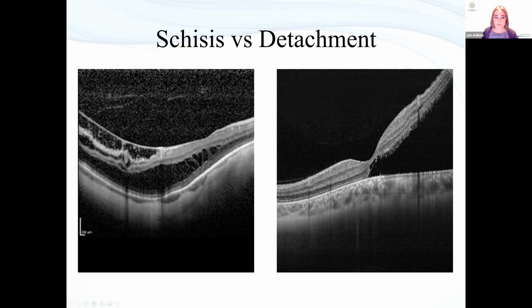And epiretinal membranes are pretty common. 10 to 15% of people get them. If you get an epiretinal membrane across this very bowed retina, it creates a bowstring effect, and it literally pulls the retina up tight like a bowstring across the staphyloma. So this is a myopic macular schisis. It's a central one. You can get the peripheral schisis, of course.